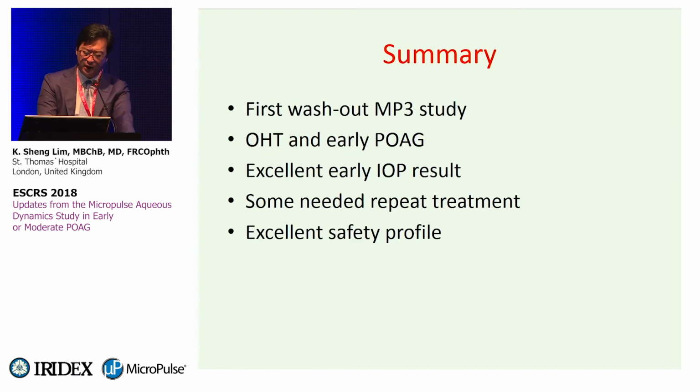But that's fine. So essentially, the summary of my study so far is that it is early days, we haven't completed the study yet, but this is, however, the first washout MP3 study using ocular hypertension or early to moderate glaucoma. So far, we have excellent IOP results. Some patients need repeat treatment, but it is really important to stress that in those eyes who have good vision, no previous intraocular surgery, and not advanced glaucoma, it is really safe. So far, anyway. And that's it.